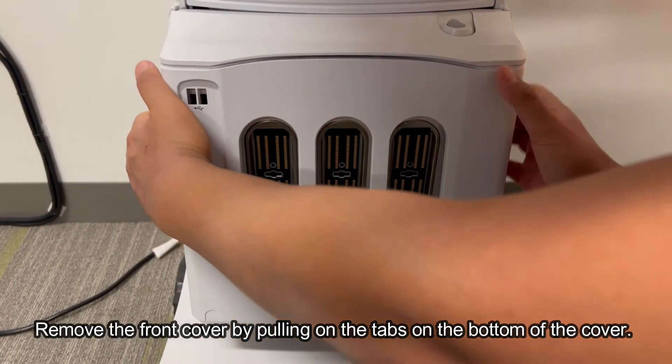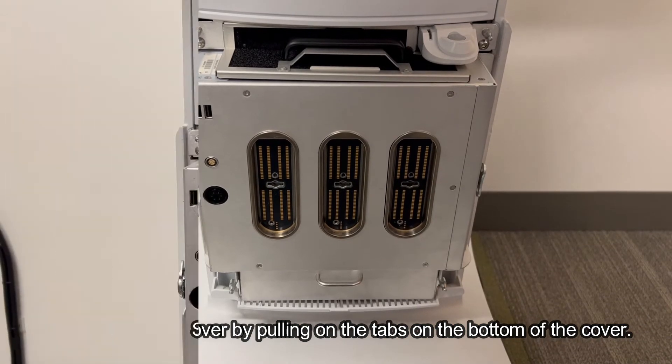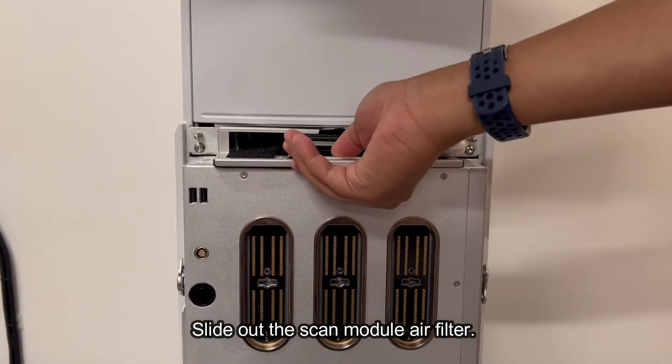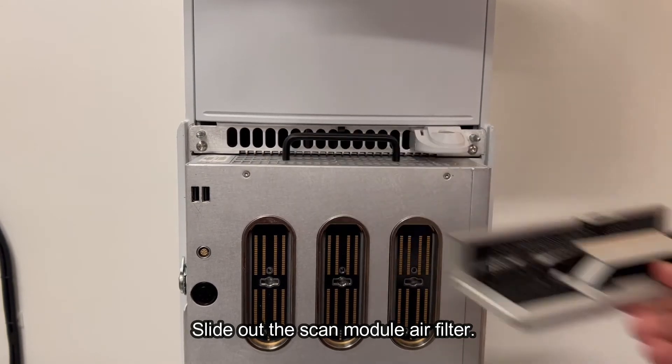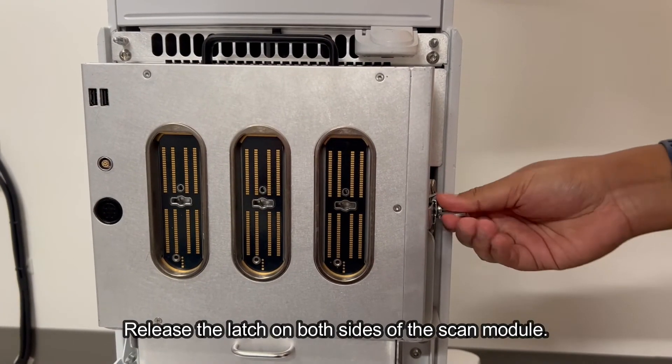Remove the front cover by pulling on the tabs on the bottom of the cover. Slide out the scan module air filter. Release the latch on both sides of the scan module.